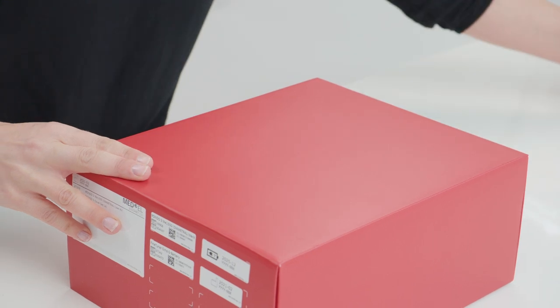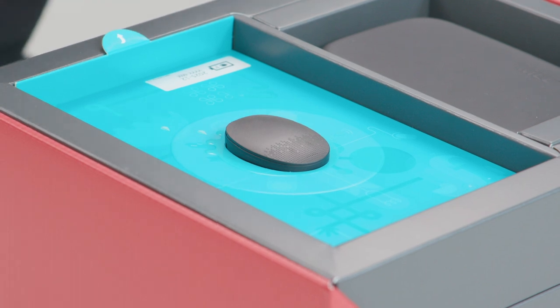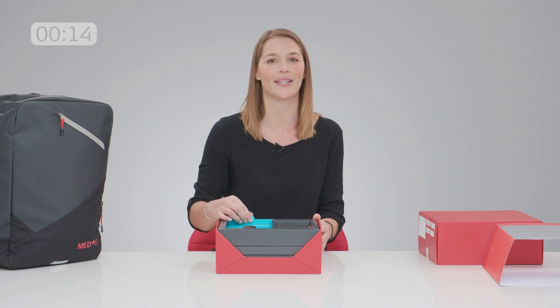Wow, nice red box. And there we have it, Rondo 3, the latest single-unit audio processor for Medel cochlear implants.